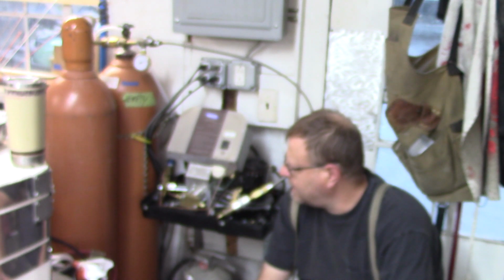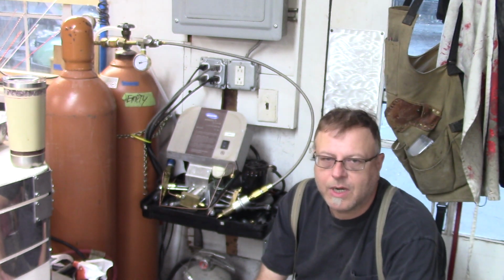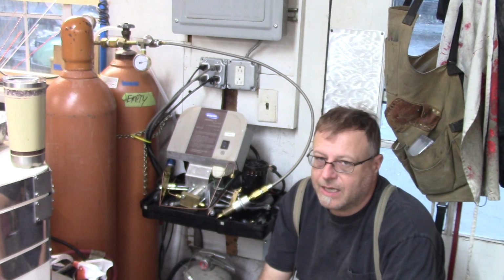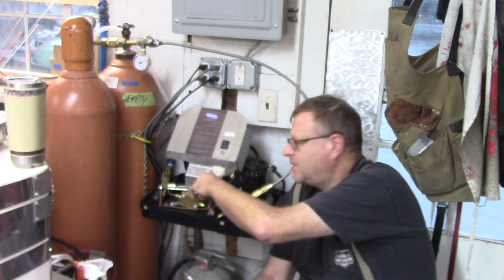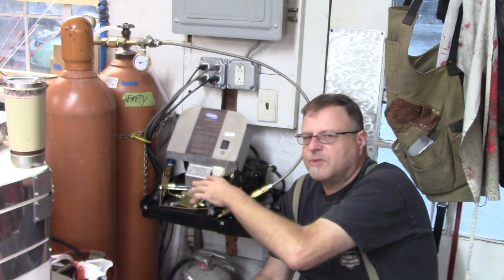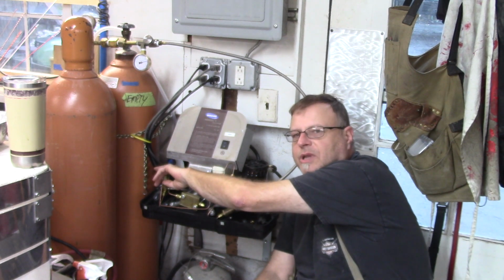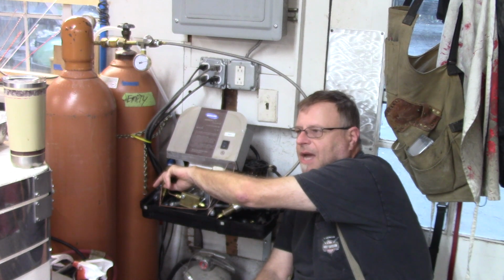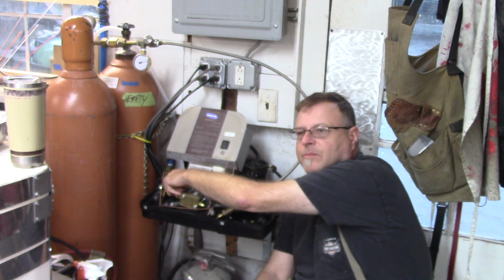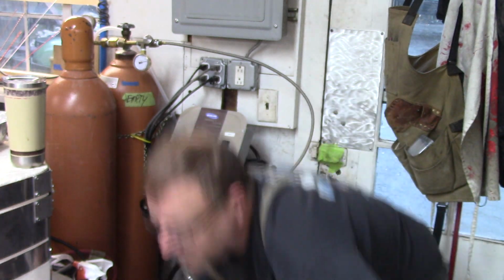So I'm going to show real quick exactly how I did that, because the machine still does work without it. The machine isn't really smart enough to know what comes out of it. There's no sensors beyond a high pressure sensor, a high pressure blowout sensor on cylinder number 5. Oh, it's actually two things. It's a high pressure shut off switch and a blowout disc. So let me show exactly what's going on here.